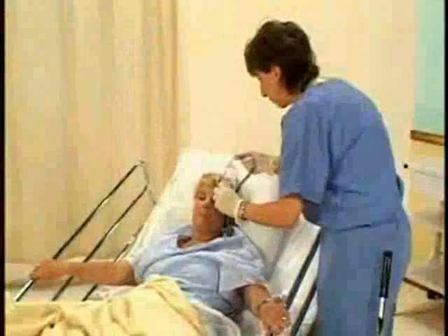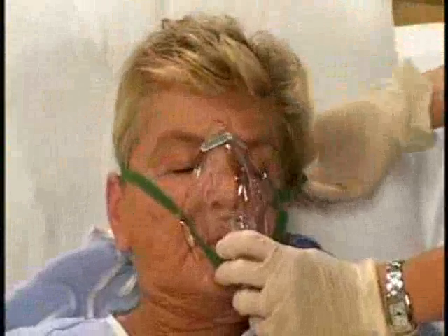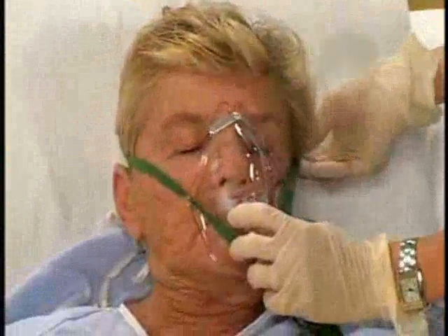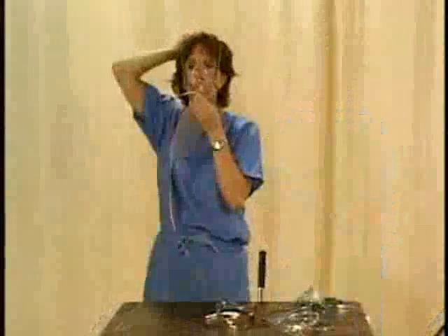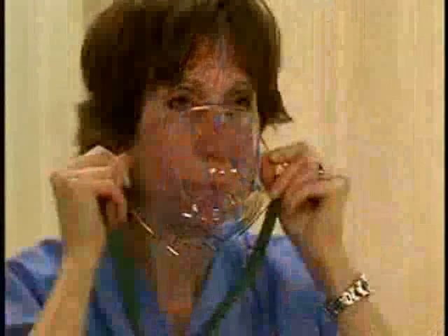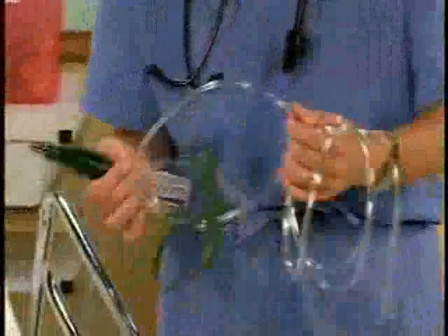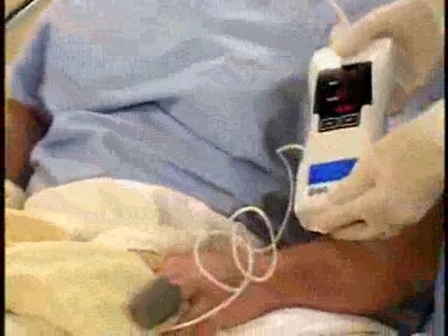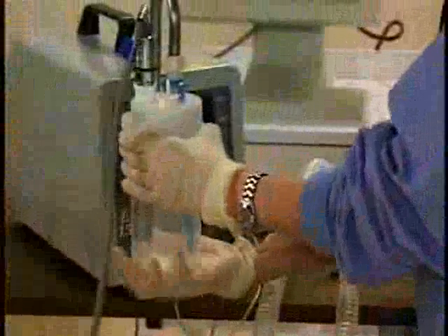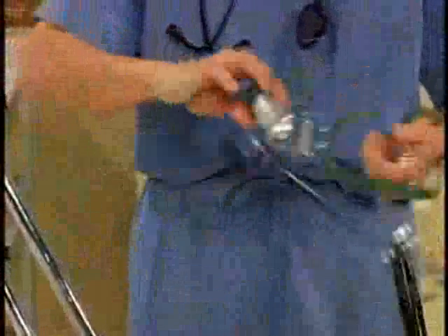When using a mask for oxygen therapy, select the appropriate type: a high-flow device, a simple low-flow mask, a partial rebreather mask, or a non-rebreather mask and face tent. Additional supplies include oxygen tubing, an optional pulse oximeter, and a humidifier with distilled water.